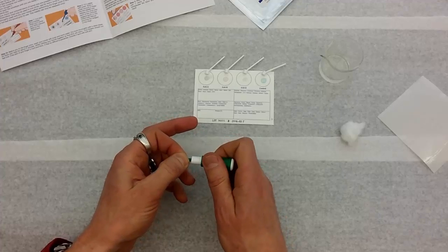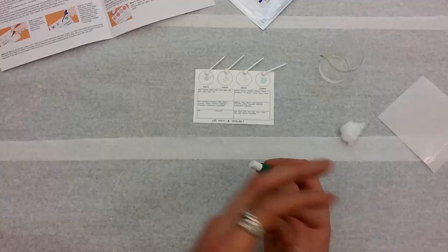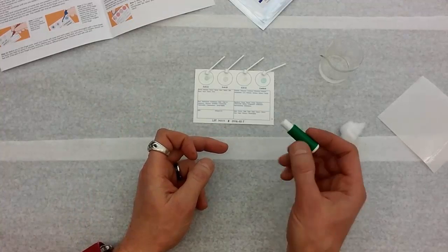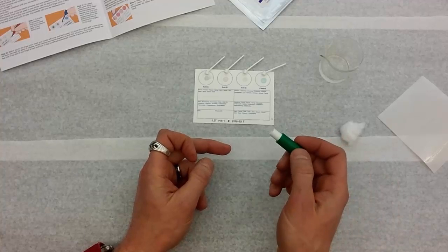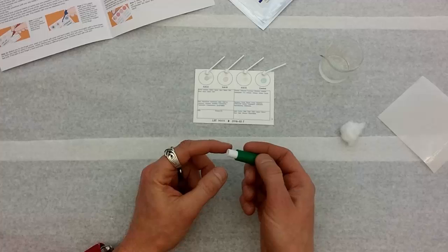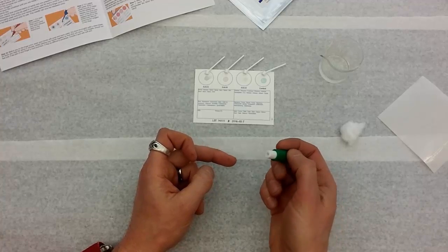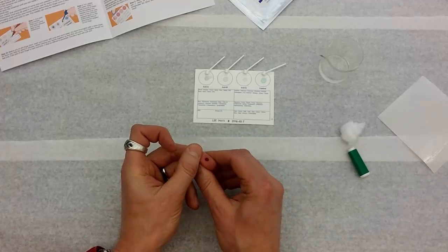Here's the poker and here's how you use it. Twist that green thing that's inside of it until you can get it out. And just pull it out and throw it away. And this thing is now ready to go. Warning about this poker, if you get this kind of poker, it is a one shot deal. It will only poke you once. I haven't found a way to reset it. So make sure you do it right the first time. Push hard and give yourself a good poke.